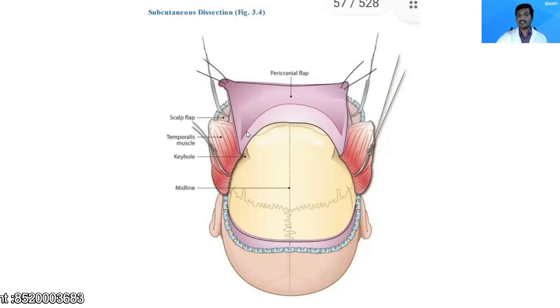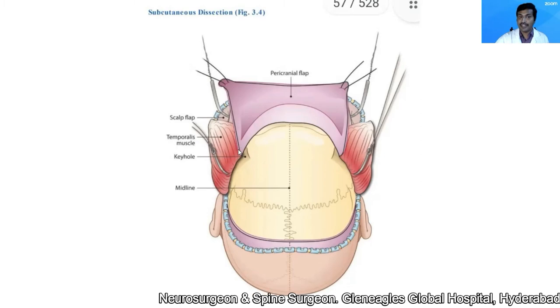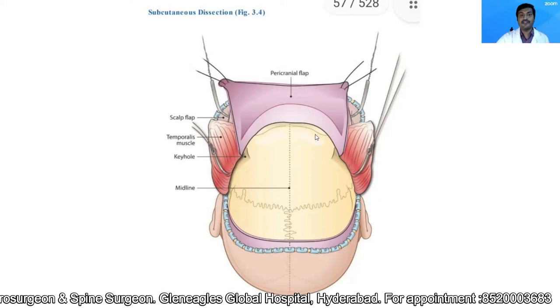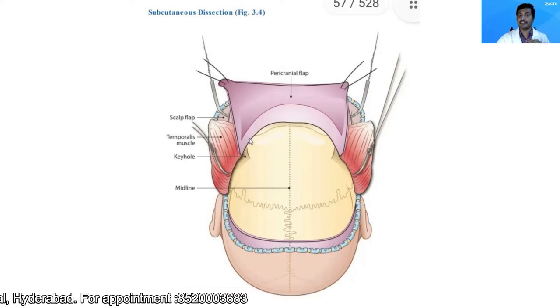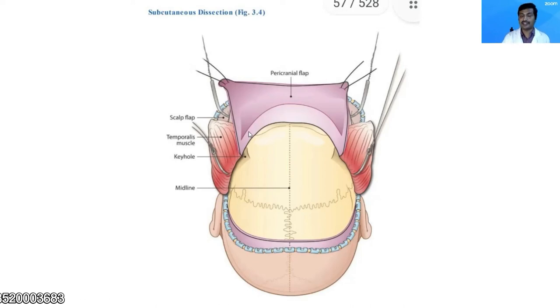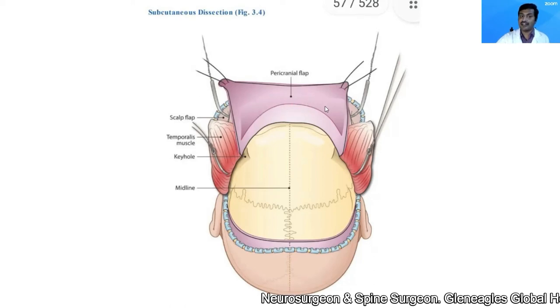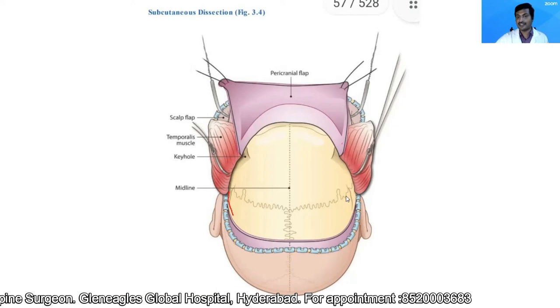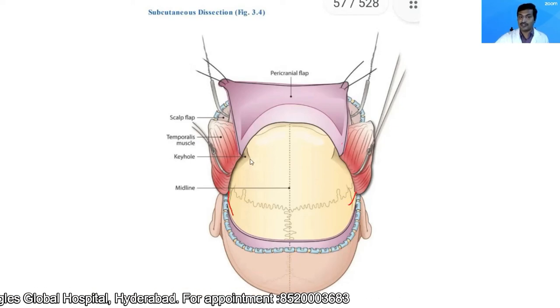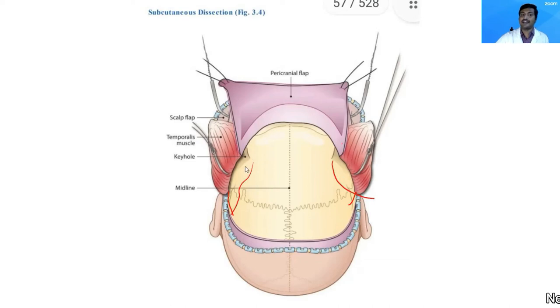Once I reach that level, I use a combination of periosteal elevator and blunt dissectors to elevate the pericranial flap. We take every effort to keep the pericranial flap intact without any holes — if there is a small hole, I suture it back. I then cut the temporalis muscle at the posterior extent of the incision and detach it from the superior temporal line on either side.